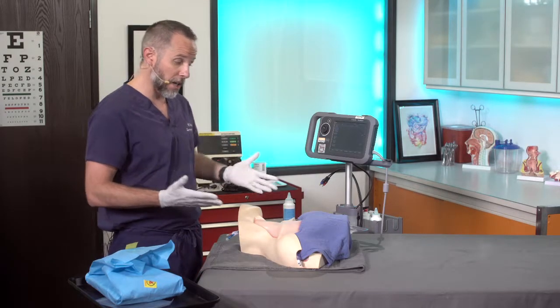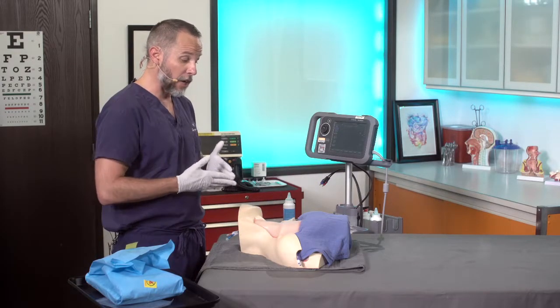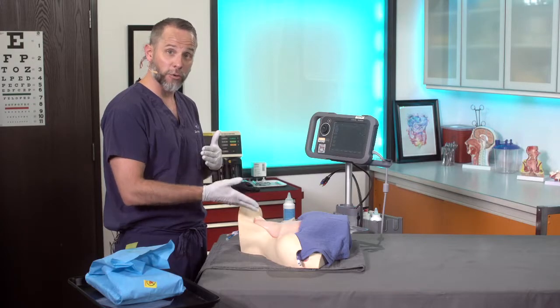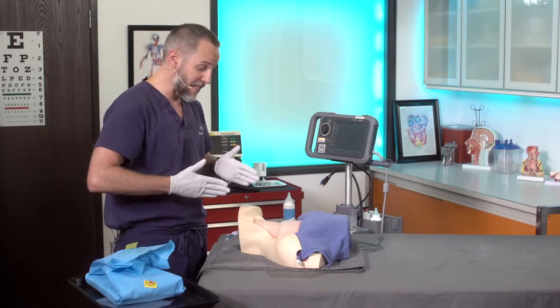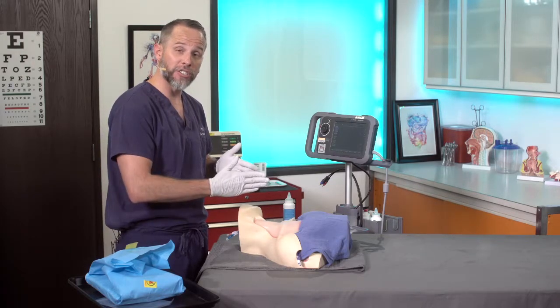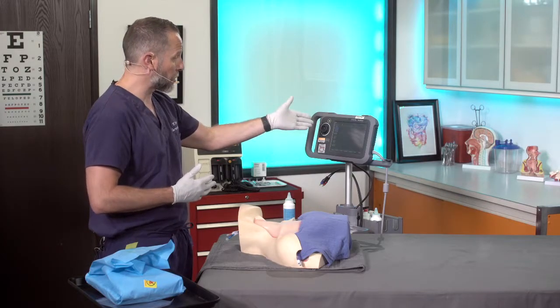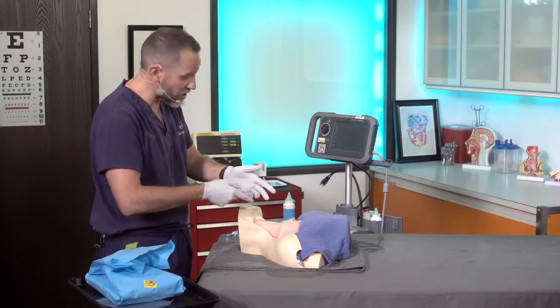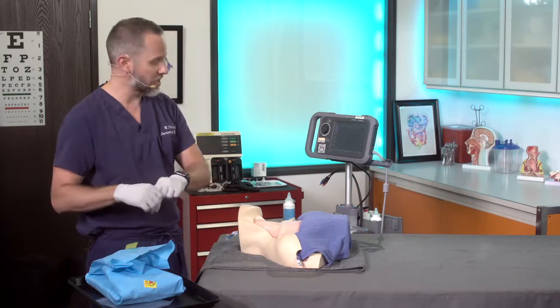Before we start, I'll have the patient lying supine and I'll be at the head of the bed. I'll usually go for the right internal jugular vein first because it's easier — I'm right-hand dominant — and if you think about it, that's a nice straight shot into the right side of the heart. When I have my ultrasound, I like to put it here so I can watch as I'm doing the procedure, and I'll have my kit here on the side.